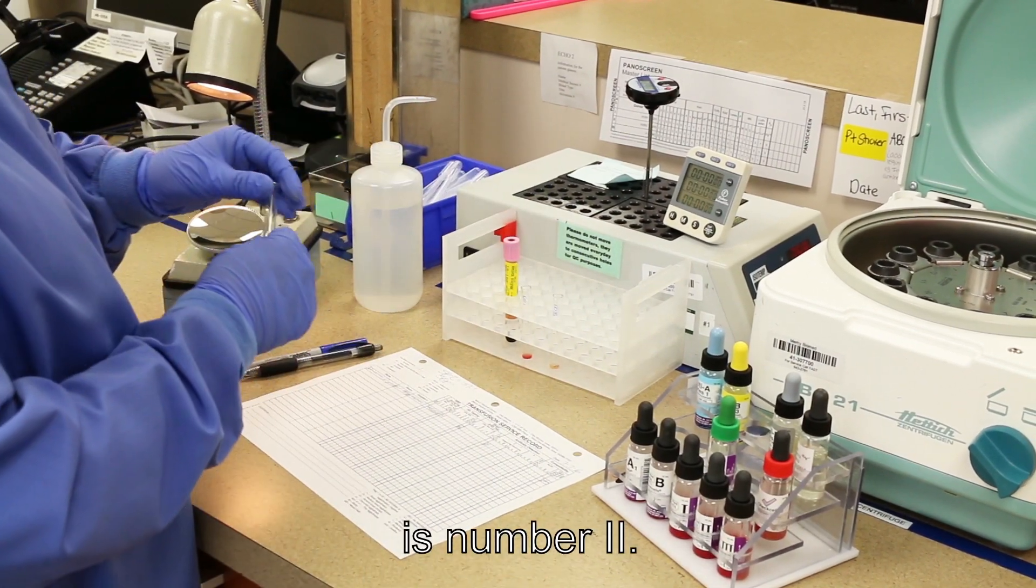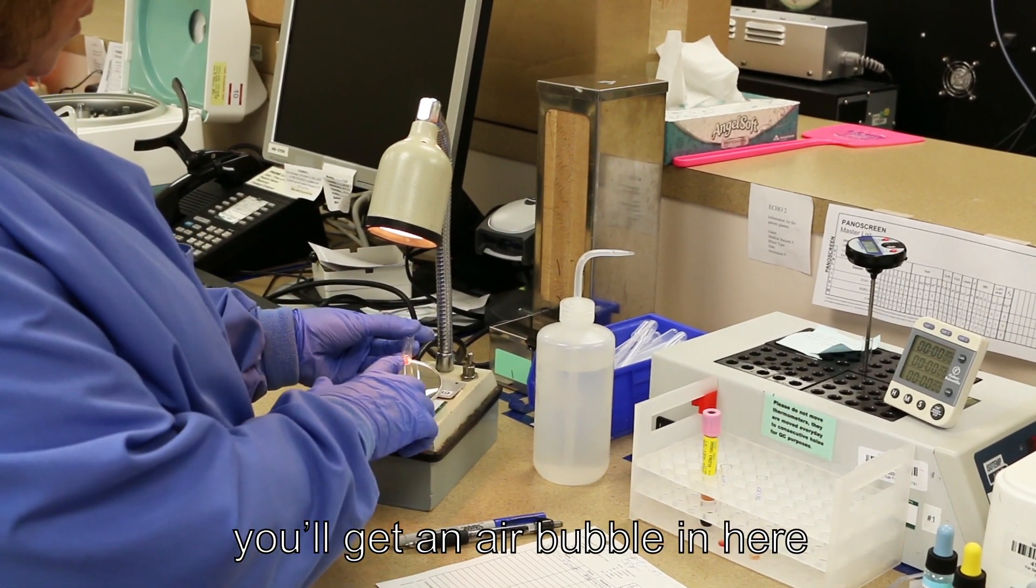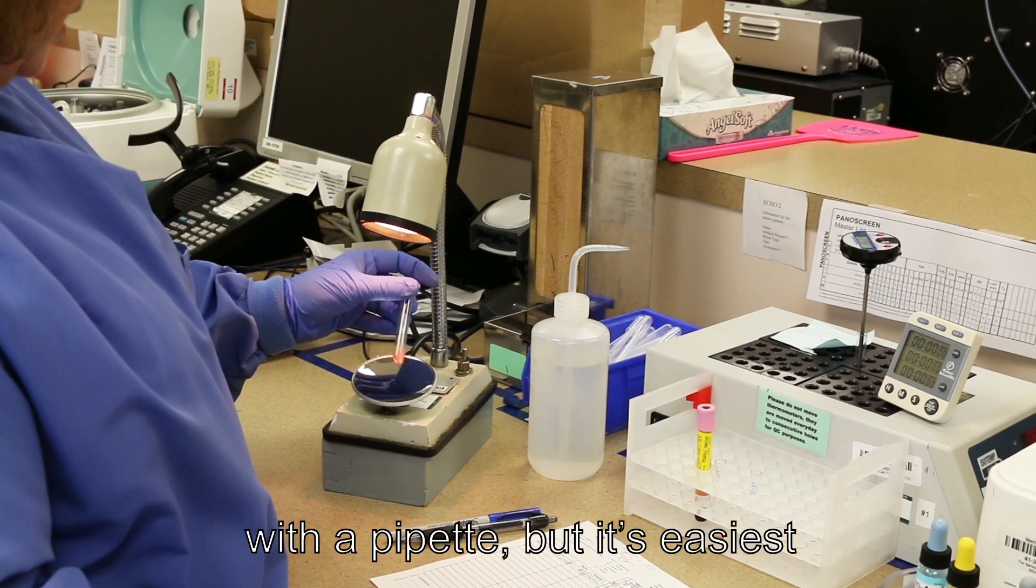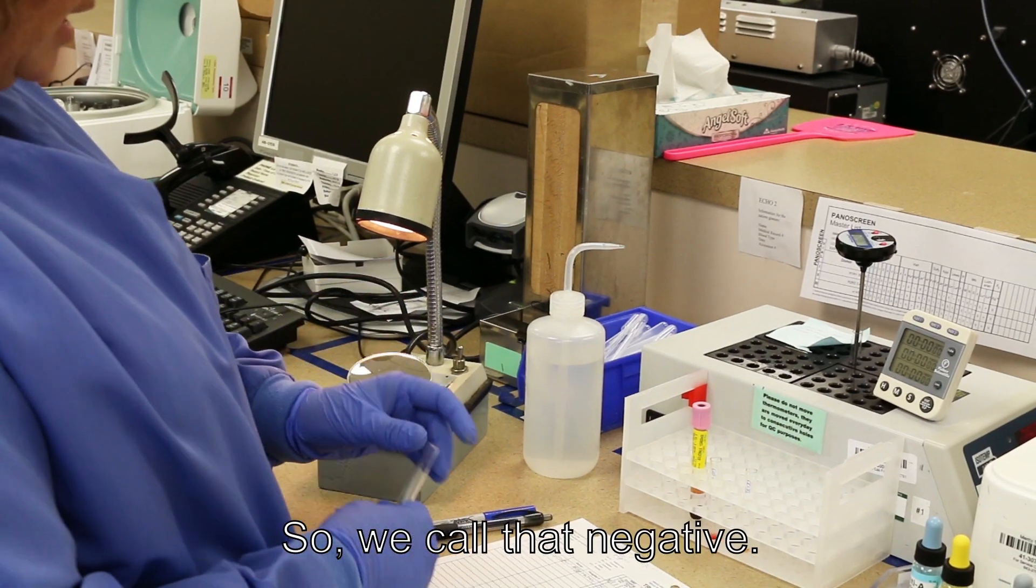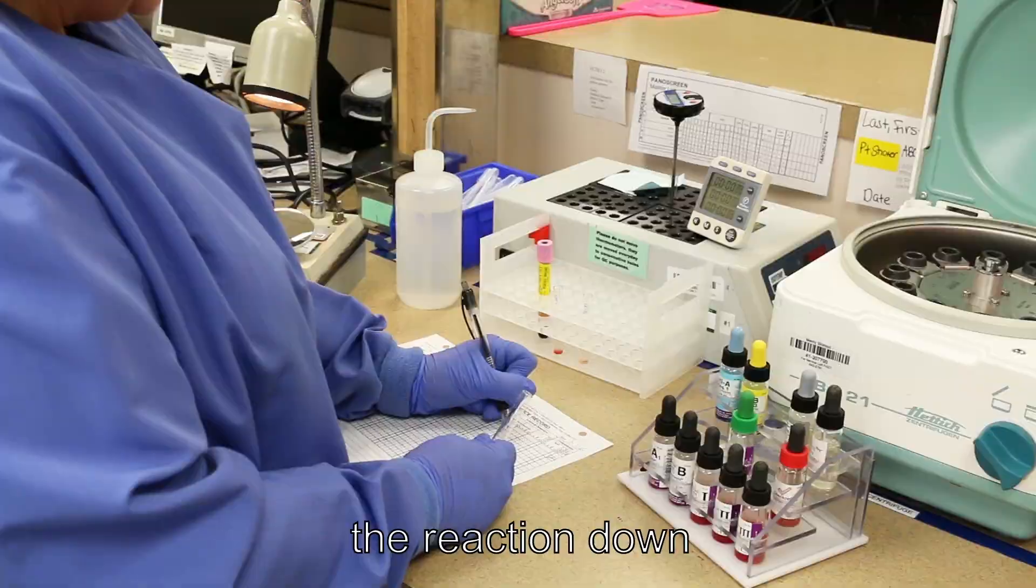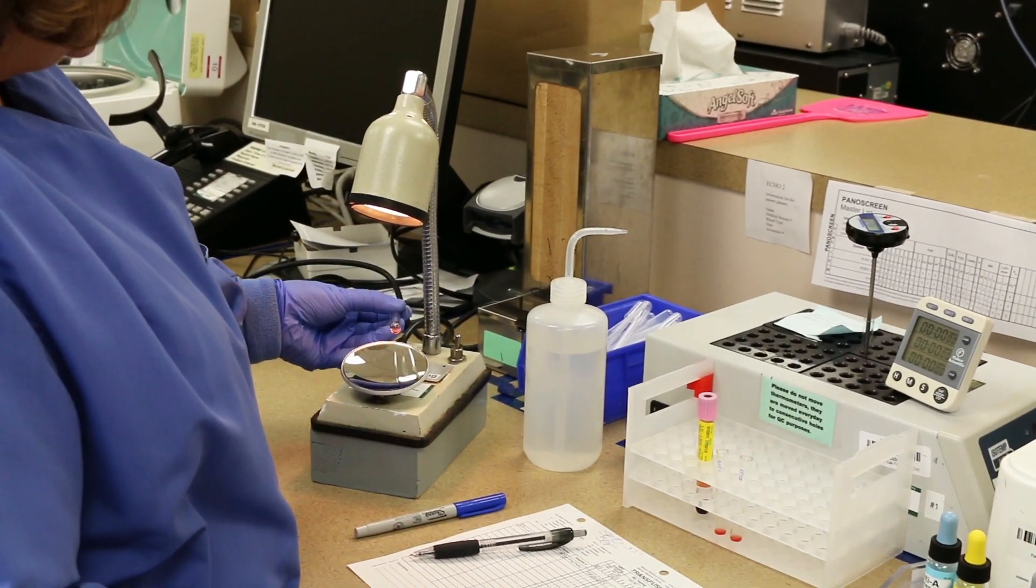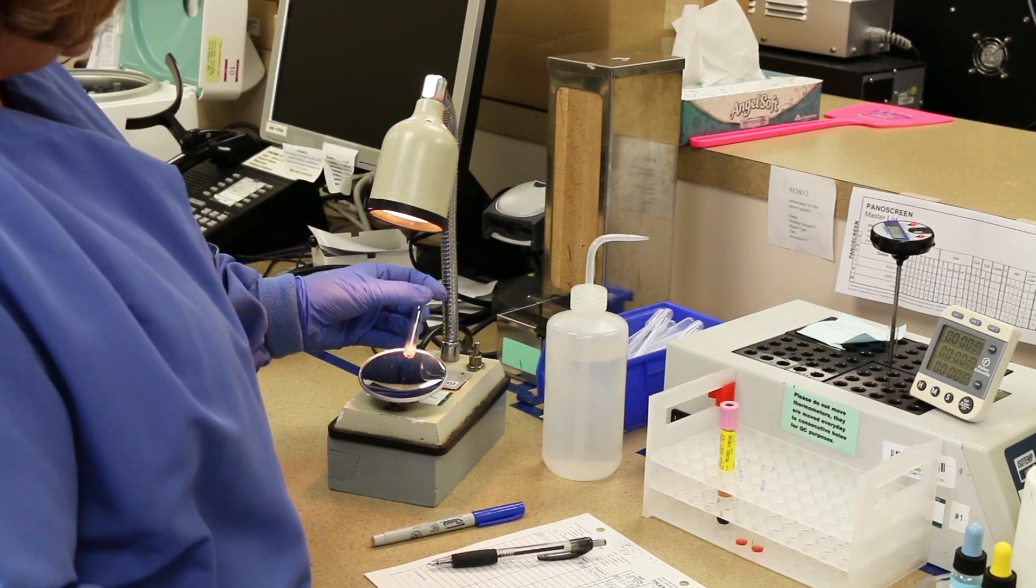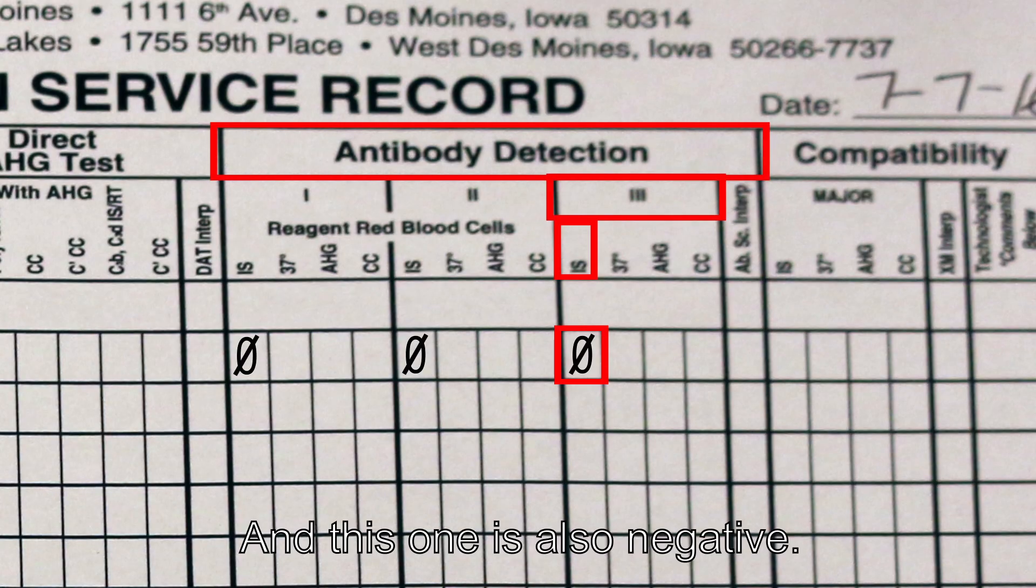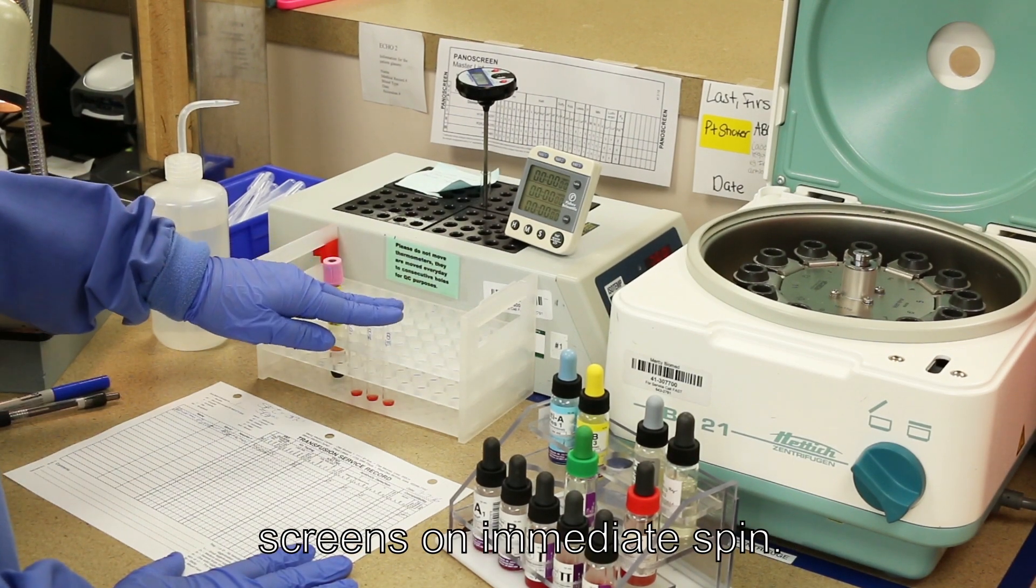The next tube we're going to do is number 2. Same thing. Every once in a while, you'll get an air bubble in here. And you can remove that with a pipette, but it's easiest just to keep going unless it obscures your agglutination. So we call that negative. Again, I'm holding the tube in my hand while I write the reaction down, so I'm not mixing up my tubes. And Roman numeral 3. And this one is also negative. So now we've read our antibody screens at immediate spin.